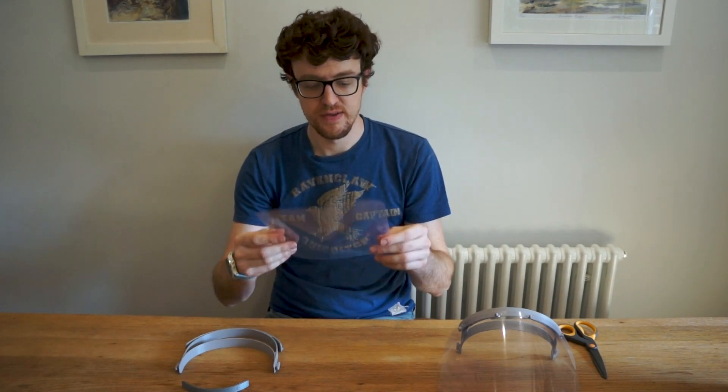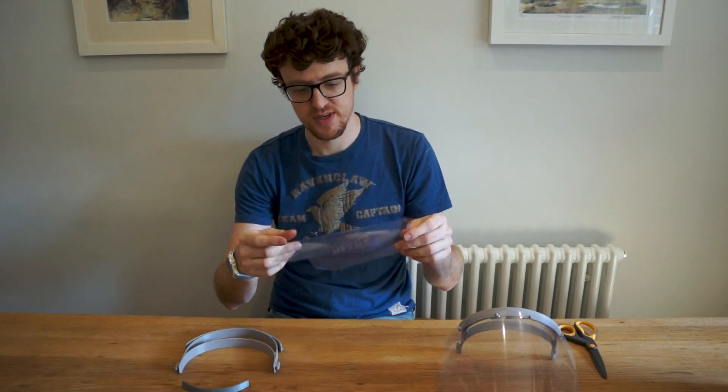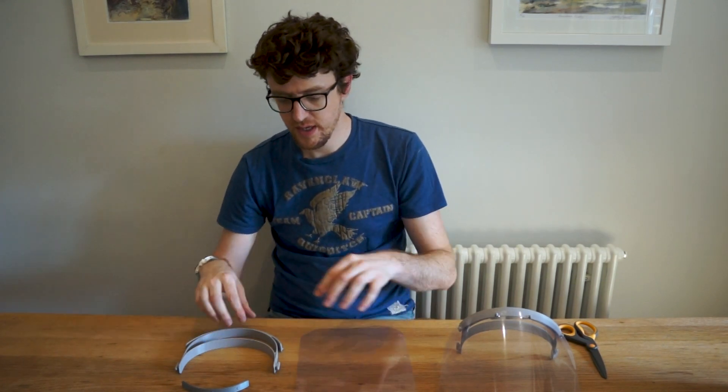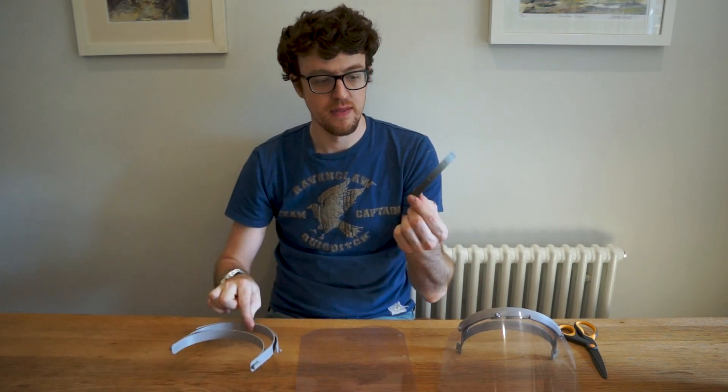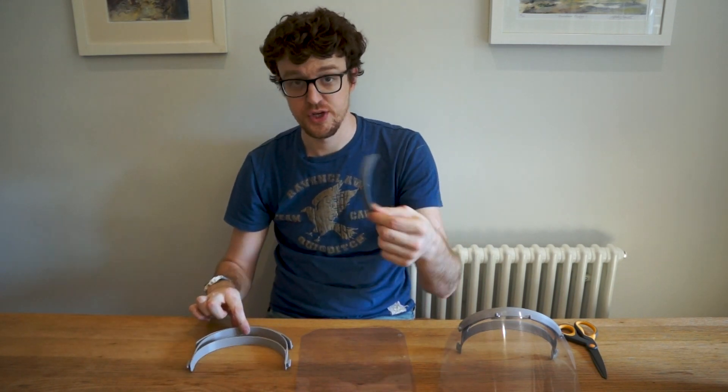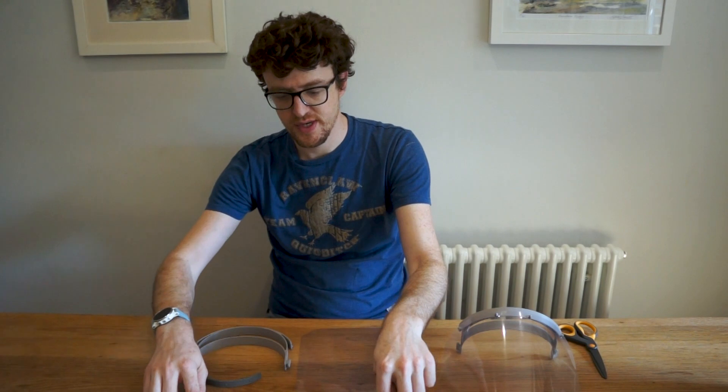Some of the plastic is like a PETG plastic which is a bit thicker — so this is probably the thinnest that you might receive. And then here you've got the two 3D printed parts: the main visor part, and then this, which is the reinforcement for the face shield part.